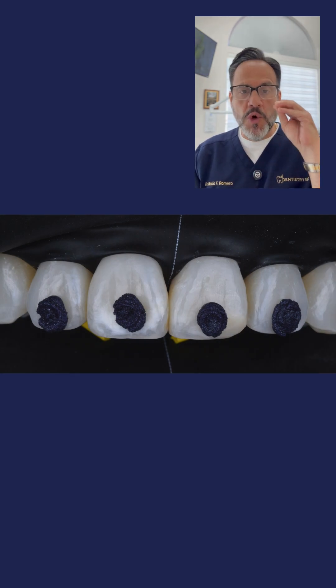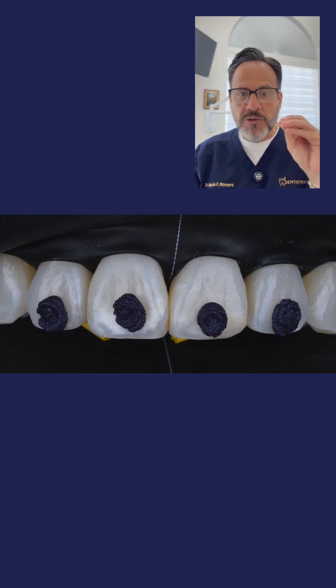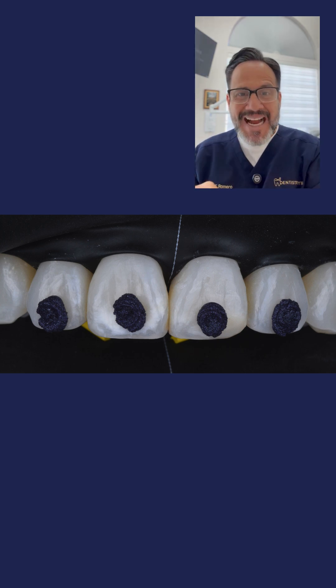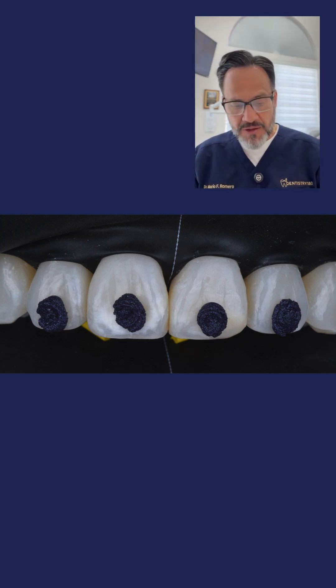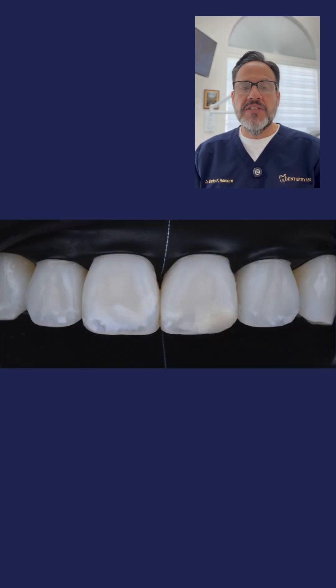So we have to go to step number three. Looking at photo number three, we're going to use Opaluster — this is 6.6% hydrochloric acid that actually alters the enamel. We're going to do micro abrasion, which is way different than macro abrasion. We did one, two, three, four rounds of micro abrasion. And if you go to photo number four, you can see that we were able to reduce the white spot lesions even more.